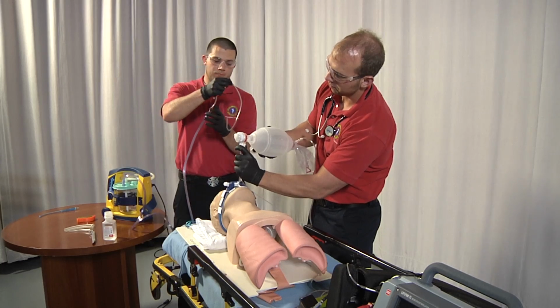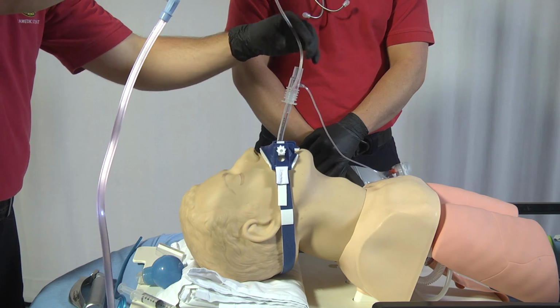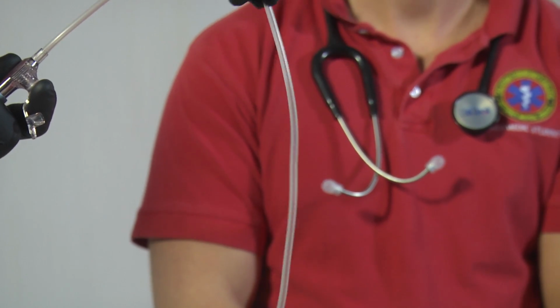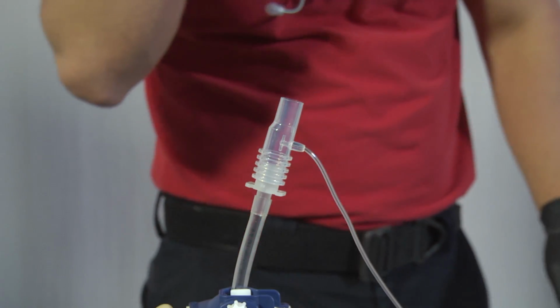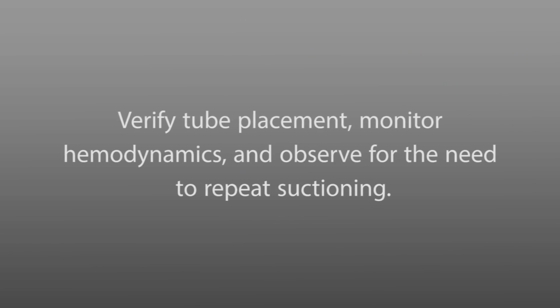Insert the flexible catheter without suction to the previously marked depth. Occlude suction port to apply suction while withdrawing the suction catheter in a twisting motion. Be sure to suction no longer than 15 seconds. Remove suction catheter, ensure ventilations are resumed, and clear suction catheter with sterile water or saline. Verify tube placement, monitor hemodynamics, and observe for the need to repeat suctioning.